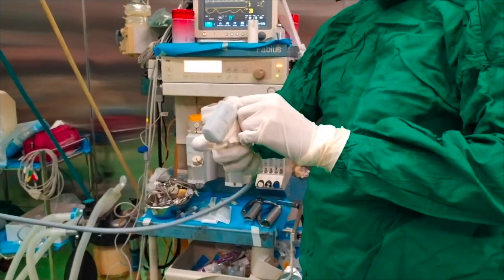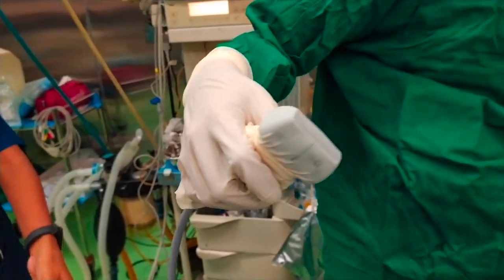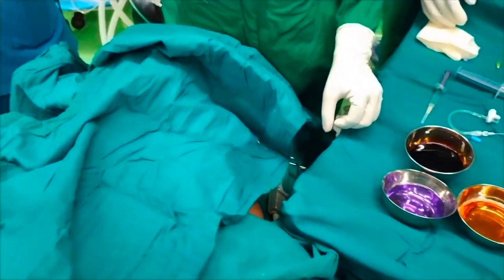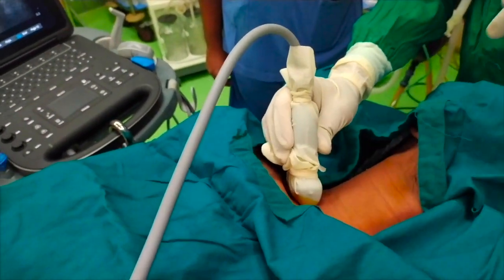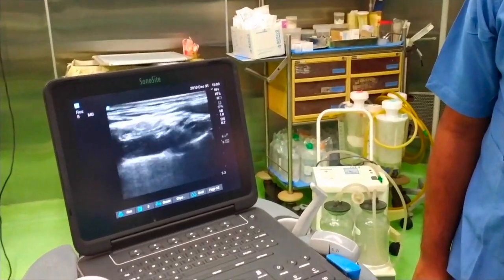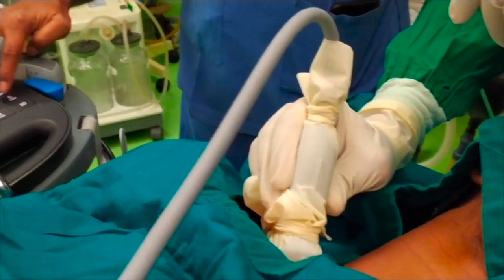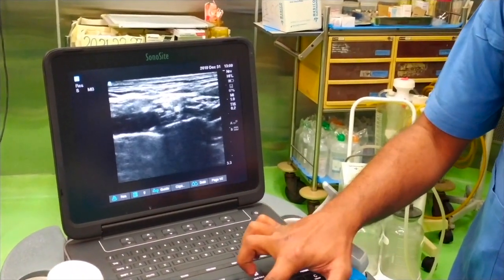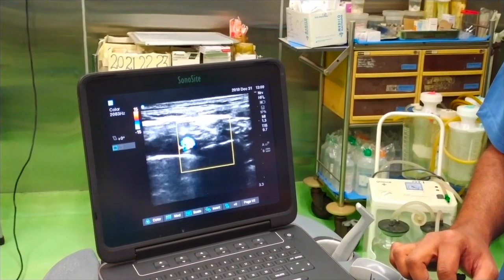Preparing the probe with sterile gloves, or we can have a ready-made probe cover. I am using betadine as a medium — we can also use sterile gel — to place between the probe surface and the skin as a USG medium. Now I am scanning for the block, putting color Doppler to correctly place my probe and avoiding that particular vascular structure, then I will insert my block needle just proximal to that branch.